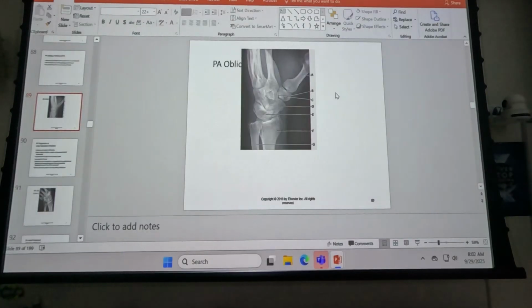If you remember, the oblique of the wrist shows us the carpal bones on the lateral side of the wrist. Also remember, whenever you're taking a test, lateral side is from anatomical position. So it's always this side. This is lateral, right? Even if you go like this, it is still lateral. So make sure that you don't confuse that. Regardless of what position you put the hand in, we refer back to anatomical position to determine medial from lateral.